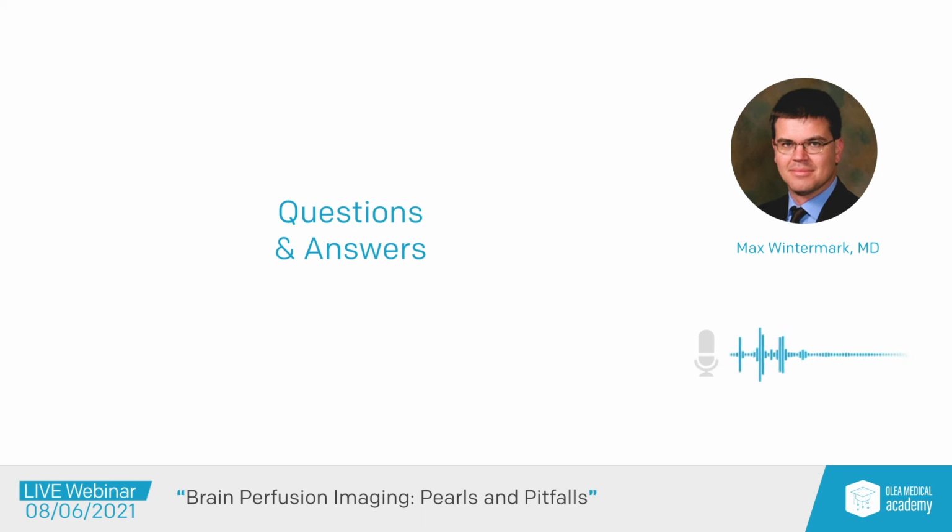Yes, so that's a great question. I think the first thing I would like to say is that's one of the main differences between MRI and CT. In MRI, we have diffusion weighted imaging, and you can look really at the viability of the tissue, and then you use the diffusion perfusion mismatch to look at the penumbra, the tissue at risk.